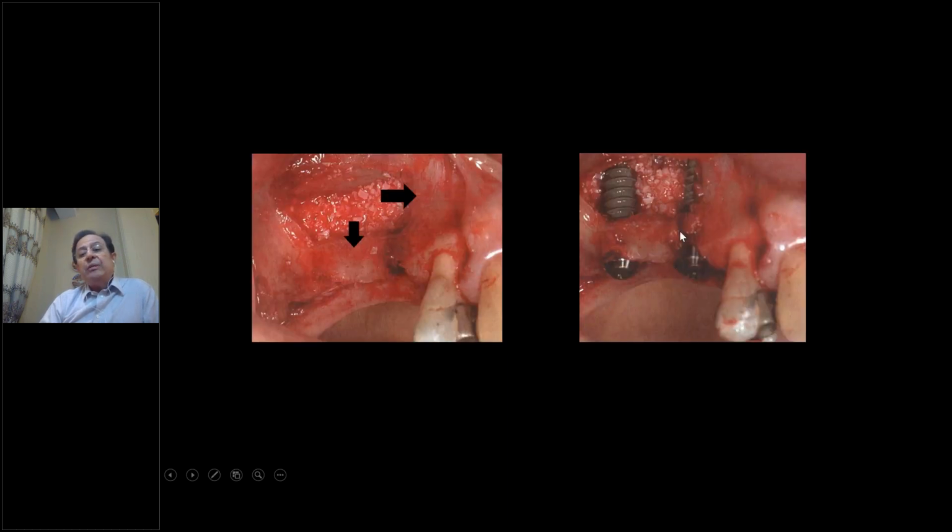If we like to put the implant simultaneously, then we must fill the sinus in the medial wall, mesial wall, and inferior. Because if we put the implant first, after that we cannot access the posterior of the implant, and maybe we will leave hollow spaces.